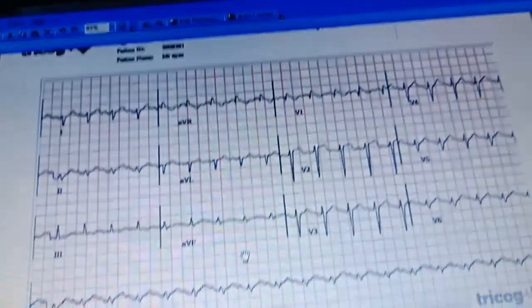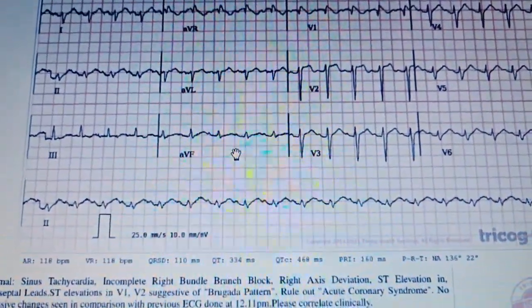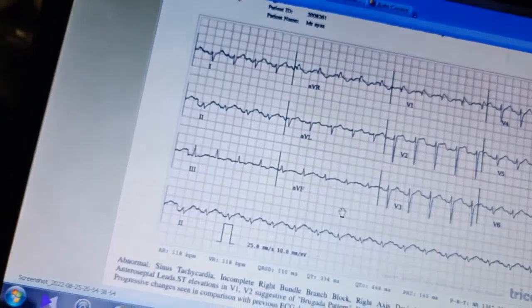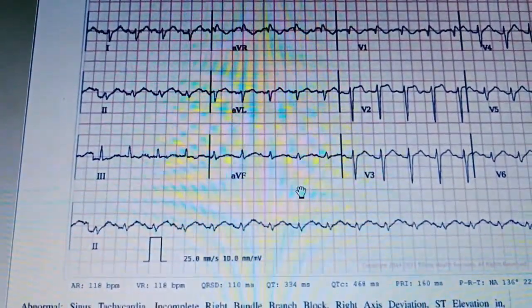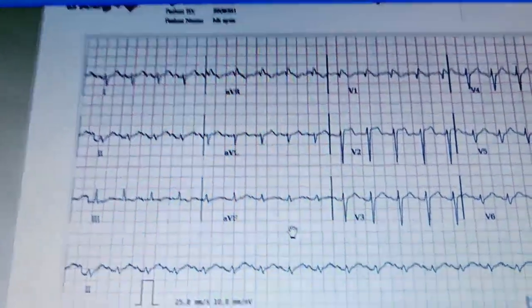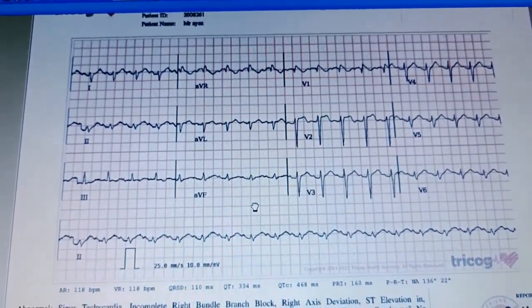Brugada's pattern is accompanied with certain other features. It confirms the syndrome. Brugada syndrome is a disorder characterized by sudden death associated with one of several ECG patterns characterized by incomplete right bundle branch block and ST segment elevation in the anterior precordial leads. Here it means the elevation of ST segment in V1 and V2 along with other features confirming the incomplete right bundle branch block.